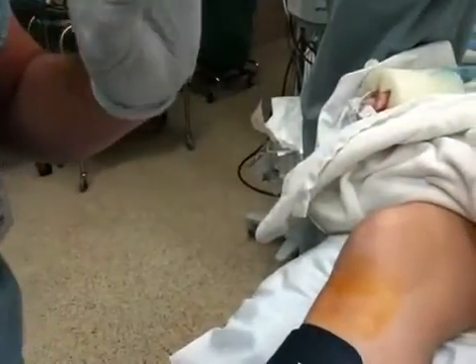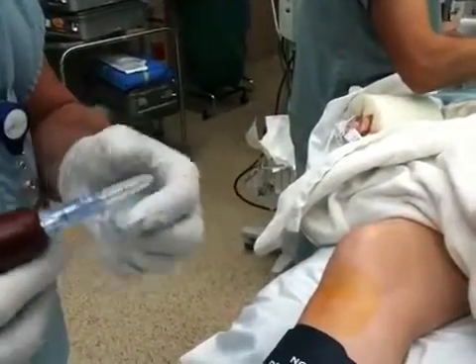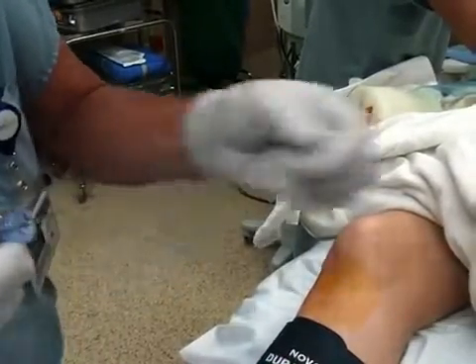Now I have the needle. It's a 25 millimeter needle. It sticks on with a magnet. You hold the cap and give it a short burst, and then the cap will come off easily.